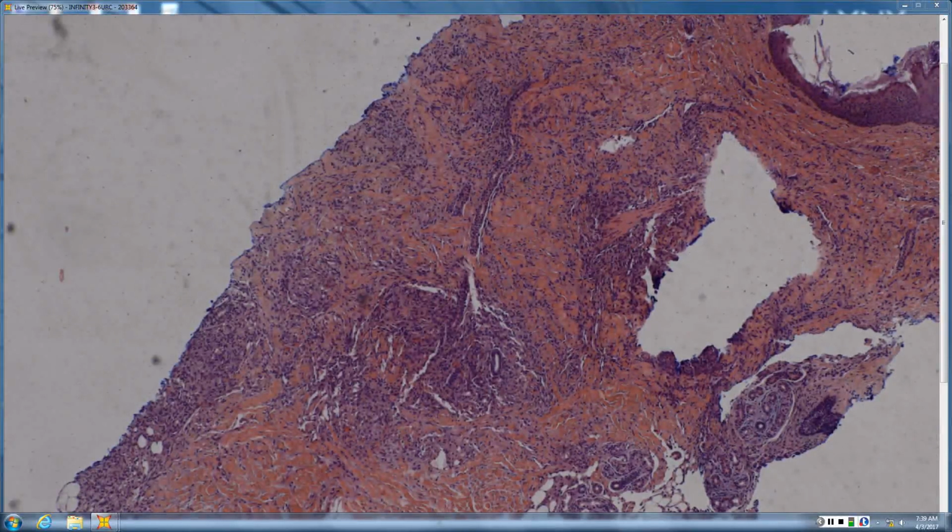It's from a baby, and it was a big tumor with a big subcutaneous component, and the child has a consumption coagulopathy. So kaposiform hemangioendothelioma. Yes, kaposiform hemangioendothelioma comes by its name pretty honestly, right? Because it's very kaposiform in the way it looks, and yet you know it's not KS because, number one, it's a baby with consumption coagulopathy, and number two, it's negative for HHV8. That'd be like a Kasabach-Merritt. So Kasabach-Merritt, exactly. It's the major tumor associated with Kasabach-Merritt syndrome.